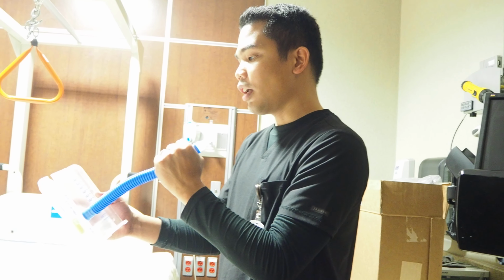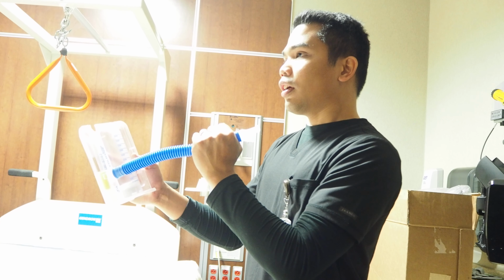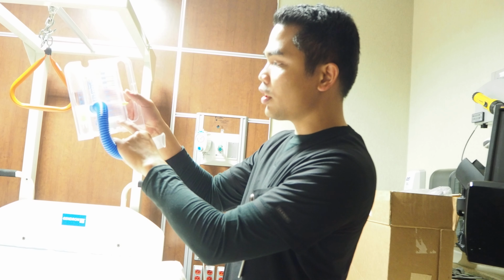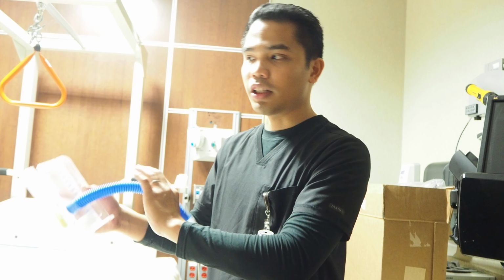And then have the patient take a slow deep inspiration, and then gradually hold the breath for about 3 to 5 seconds until this white piston would drop, and when it drops to 0, remove the mouthpiece and exhale normally.